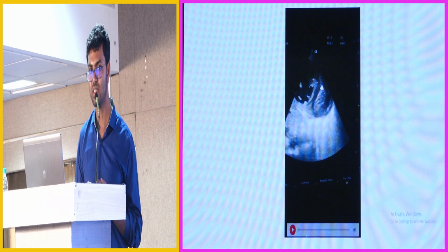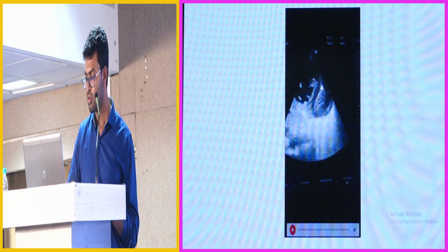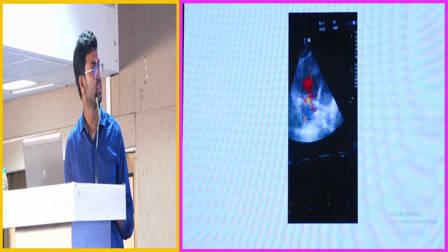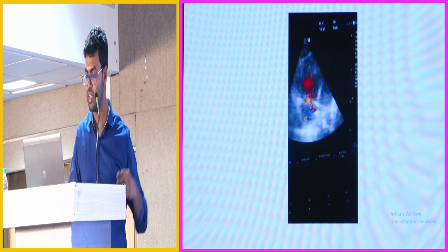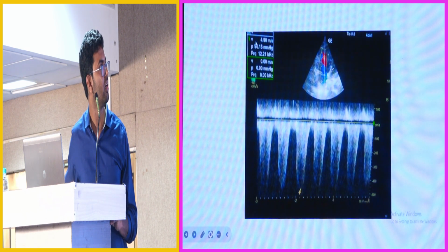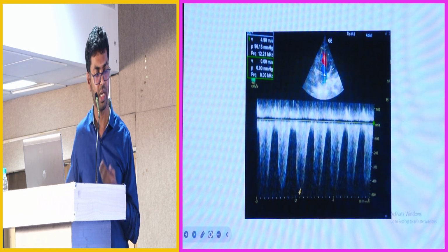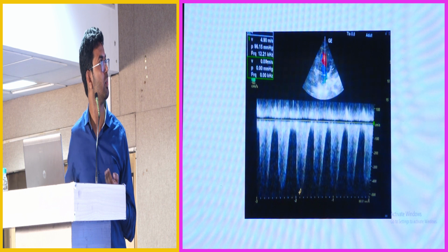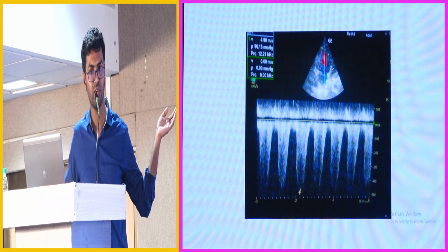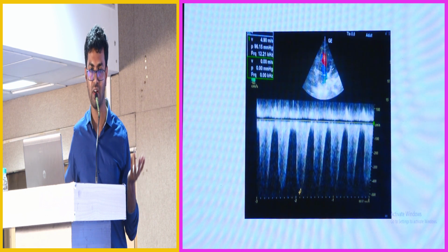Because these ILD patients are prone to slowly develop pulmonary arterial hypertension. So we looked at the TR in this patient. The RV is huge and there is a TR, and we calculated the gradient: there is a gradient of 96 across the tricuspid valve. That means the right ventricular systolic pressure will be around 96 plus CVP. The CVP in these patients will be around 20, so the RVSP becomes around 110.